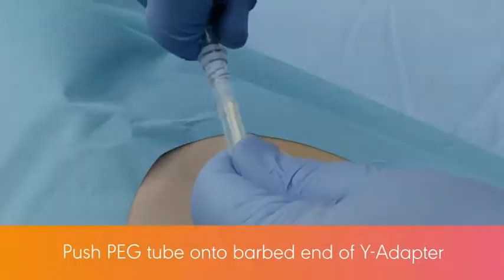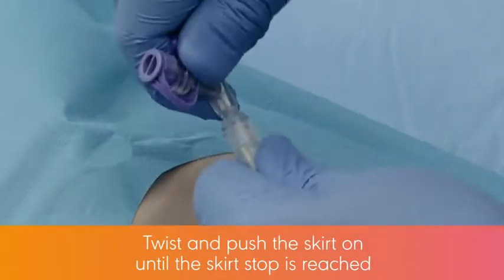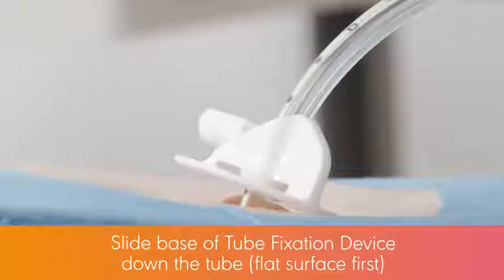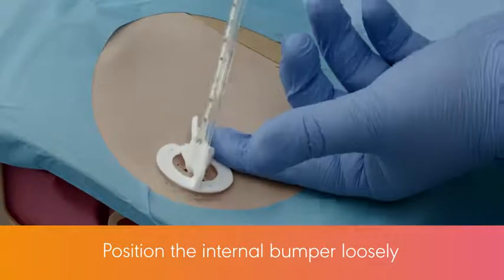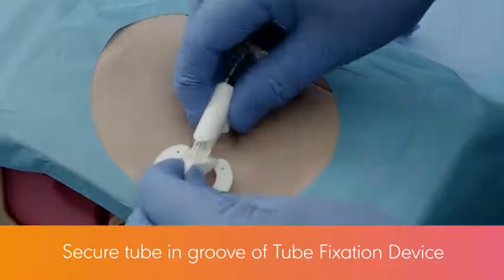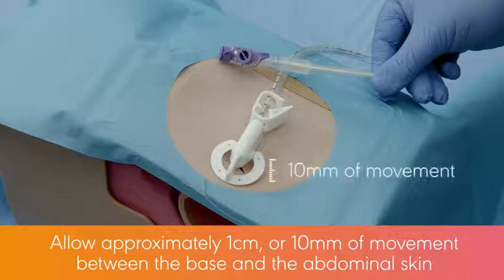Push the peg tube onto the barbed end of the Y-adapter. Important: push over the barb until the tube stop is reached. Twist and push the skirt on until the skirt stop is reached. Slide the base of the tube fixation device down the tube, flat surface first, to the abdominal wall. Under endoscopic visualization, position the internal bumper loosely against the gastric mucosa — there should be no blanching of the gastric mucosa. Secure the tube in the groove of the tube fixation device base and slide the tube fixation device cover pointed end first down the tube to engage with the base until a click is heard. Allow approximately 1 cm or 10 mm of movement between the base and the abdominal skin.